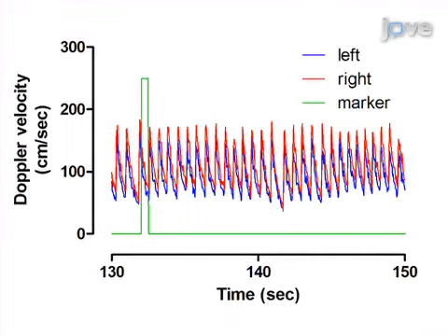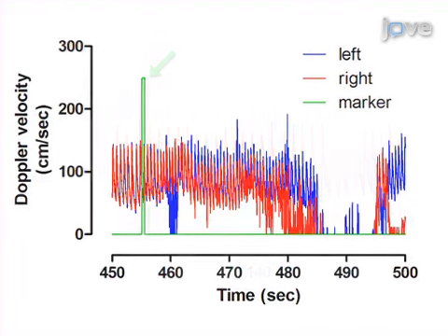Here is a clean data recording of raw blood flow velocity during one experimental trial. Each visible pulse corresponds to one heartbeat. The event marker indicating stimulus onset is displayed in green. Here you can see data recording for a portion of the experimental session when the signal was poor and intermittently dropped out. These sections are automatically removed from the record by an artifact rejection procedure.